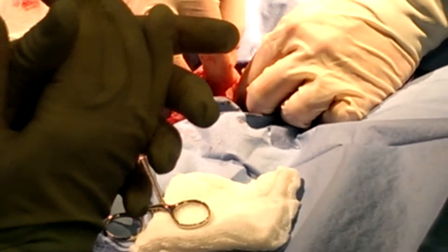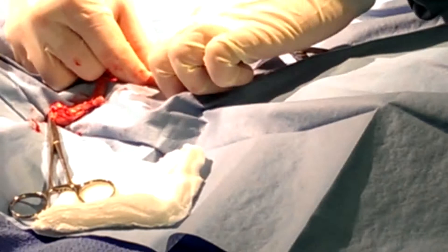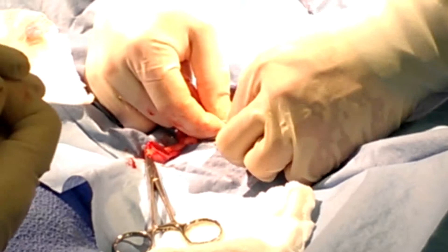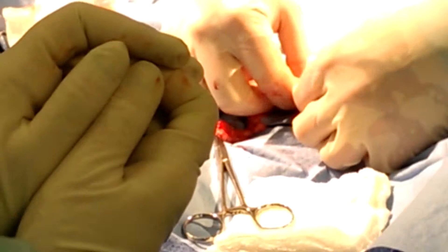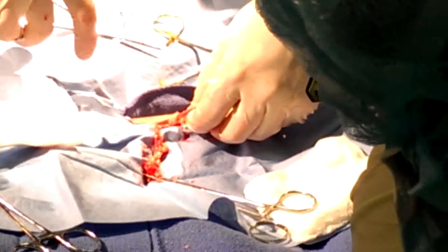Here's our next ovary — that's a little more lima-bean-ish. Here's our suspensory ligament — we've got a twang. One, two, three — this will pop on that one. That's the natural ligament. We'll gently strip away some of the fat. Be careful — we don't want to tear vessels.